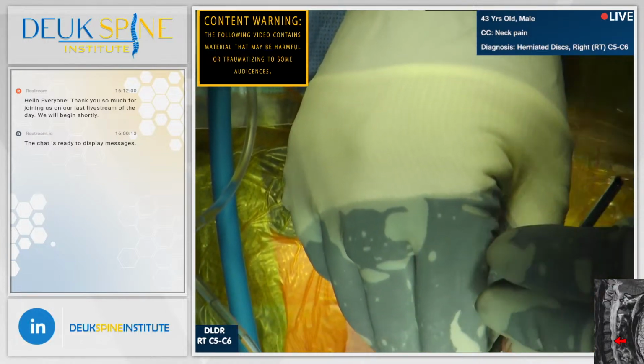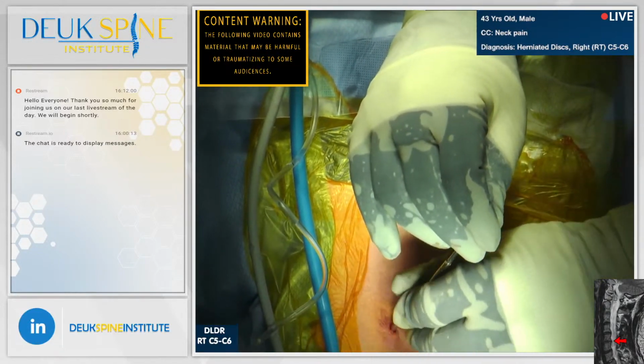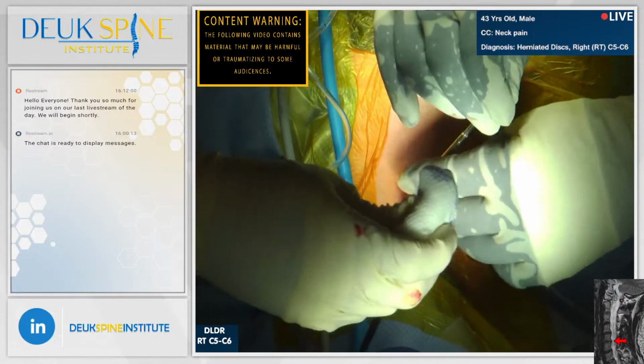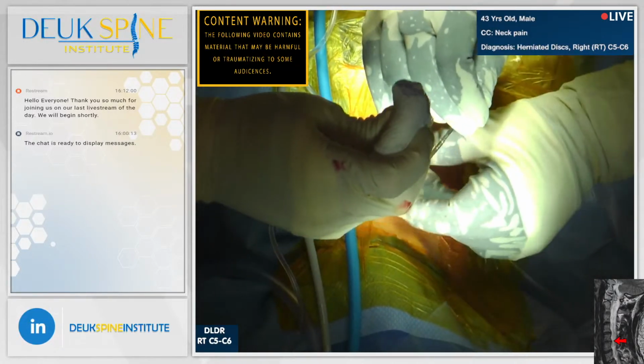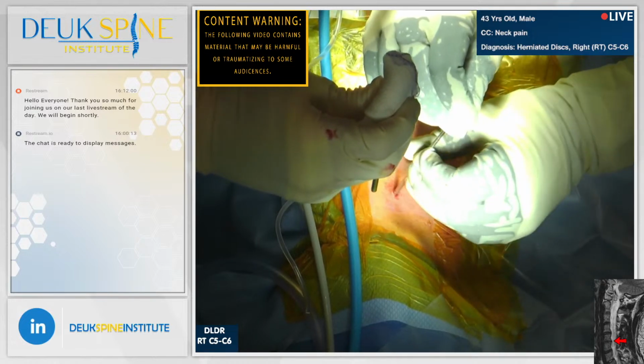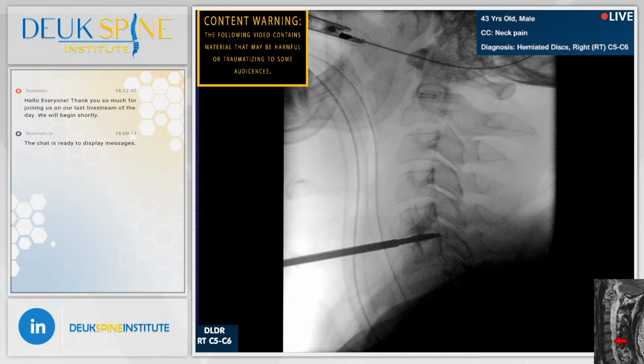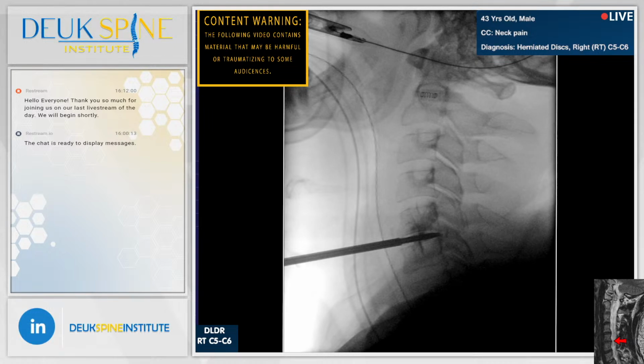So we're going to bring this tube down over the dilator. It's going to slide down all the way to the front of the spine. Meanwhile, you want to watch your dilator, make sure it doesn't go in any further. That's Luis's job for me. He's my point man, meaning he watches the point of the dilator to make sure that if I'm looking somewhere else, it doesn't go in any more. And we're just going to gradually advance the tube over the dilator. Very nice.